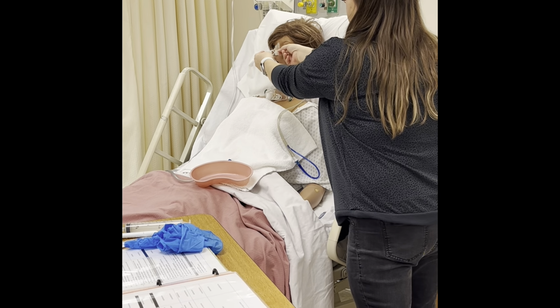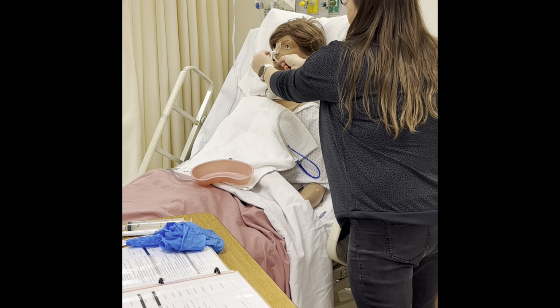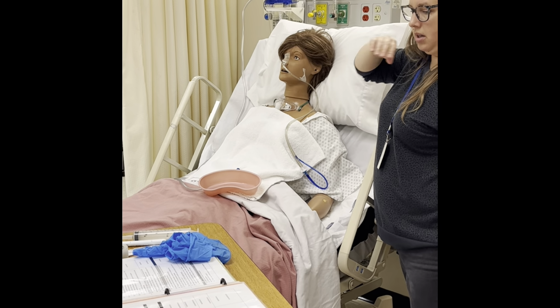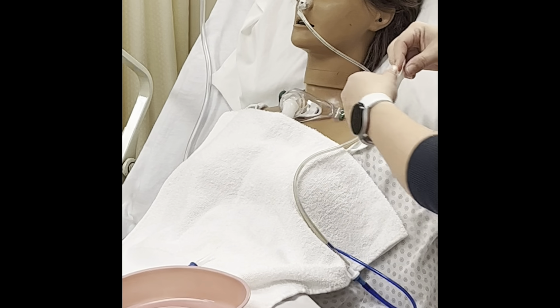The legs, we're going to take one and wrap it around completely. Take the other one, wrap it around, but you don't want to obstruct the other side of the nose. Do you see that? How we're trying to keep a little obstruction. Then we're going to take the temporary anchor out.